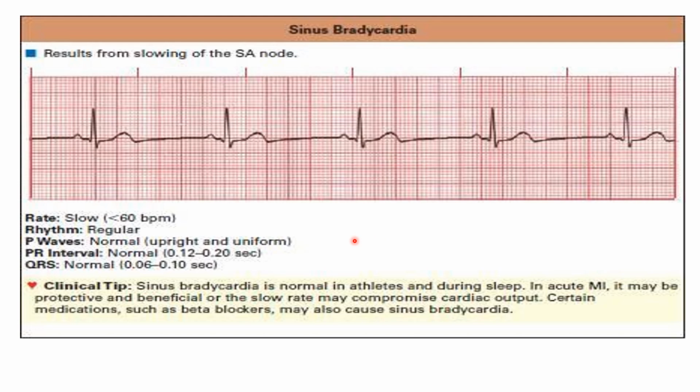We also have to look at these factors. If we see the heart rate is below 60, we will call it slow, but we need to consider these factors as well to call it sinus bradycardia. So when we have an ECG, we always count our heart rate in 6-second strips.